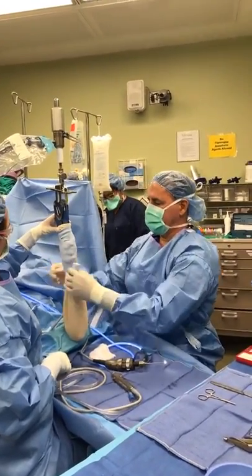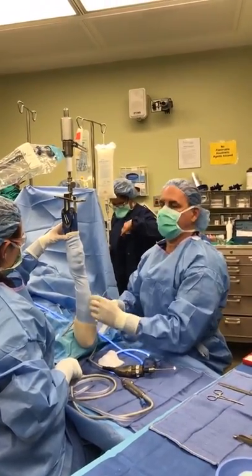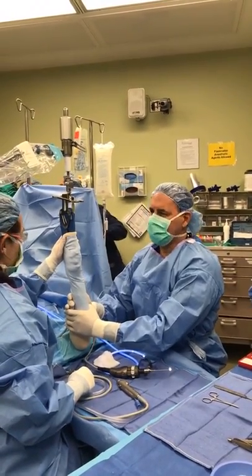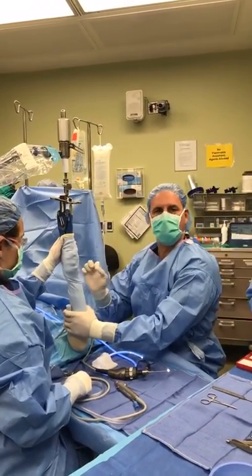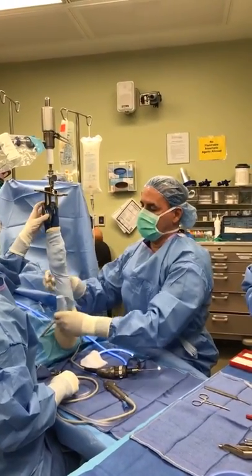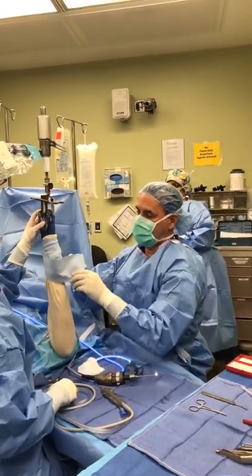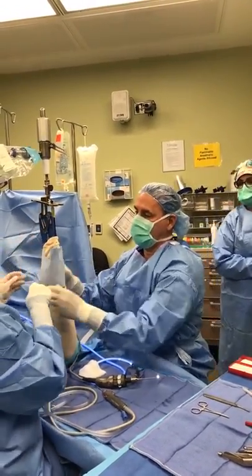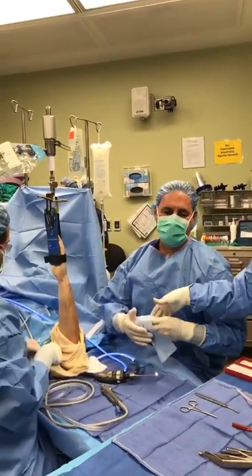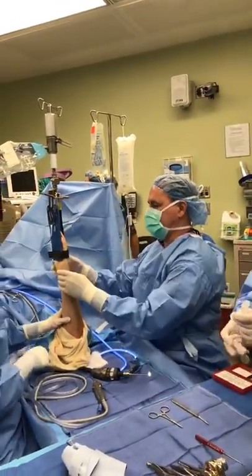We are what we're calling exsanguinating the limb. This is a gentleman who came from South America. He's actually had 12 years of wrist pain. Obviously, he could live with it, but it was interfering with activities and sports, and he had seen many physicians in his home country, had PRP injected and all kinds of things, and really never had a solution, because we've never had a clear diagnosis.